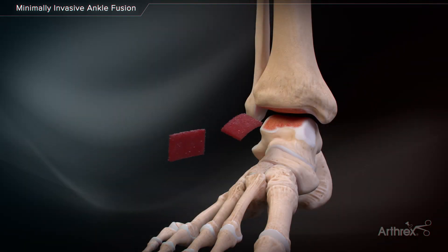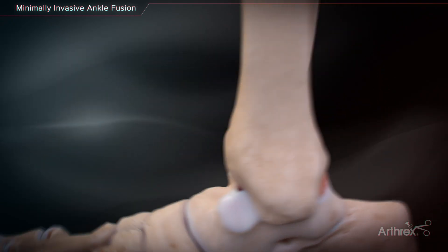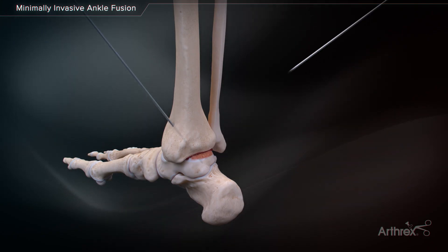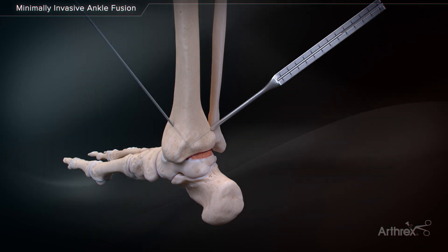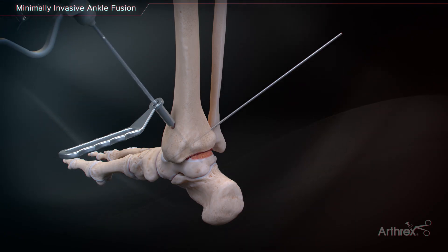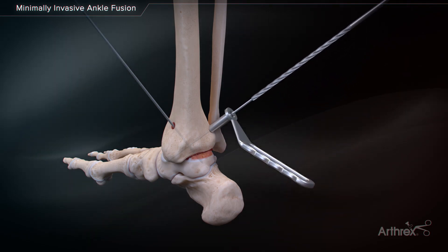For ankle arthrodesis, Allosink demineralized sponges soaked in BMA can be placed at the fusion site for maximum biologic healing. Provisionally fix the ankle joint in the appropriate position with 2.4-millimeter guide wires. Measure the initial guide wire length using the depth device. It may be necessary to subtract from this length if the desired screw placement is to be countersunk, or to account for compression achieved.